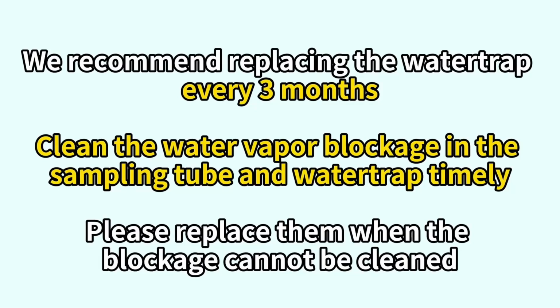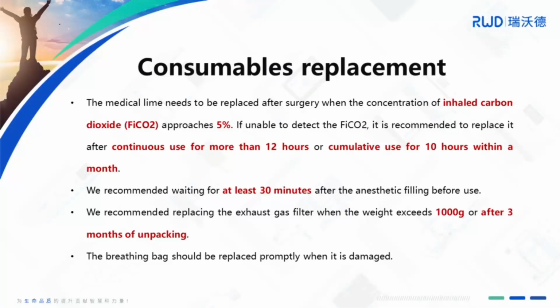We recommend replacing the water trap every 3 months. Clean the water vapor blockage in the sampling tube and water trap in a timely manner. Please replace them when the blockage cannot be cleaned. Please check the video for guidance on replacing consumables.